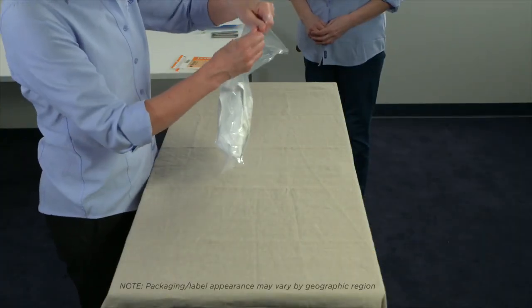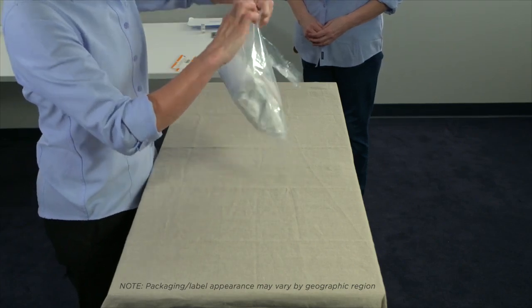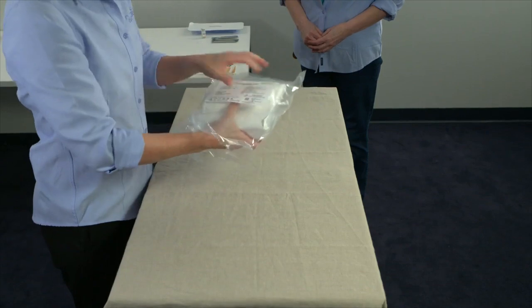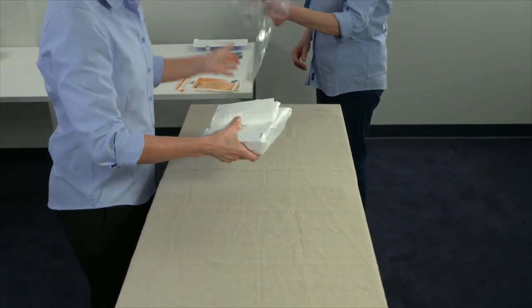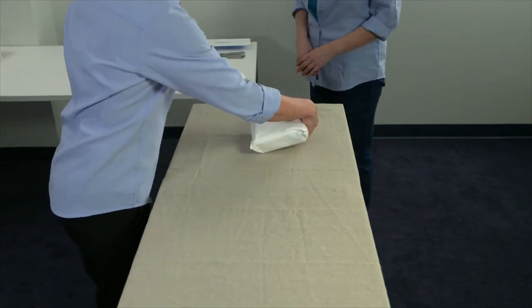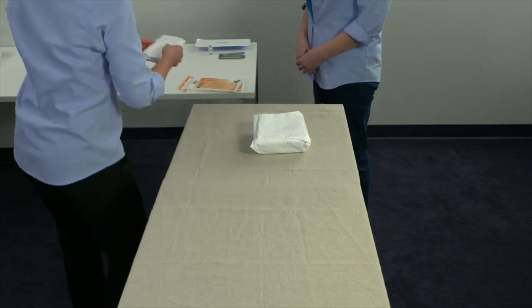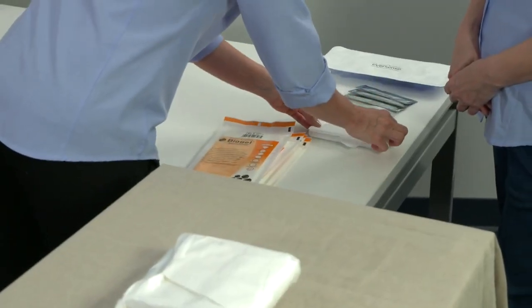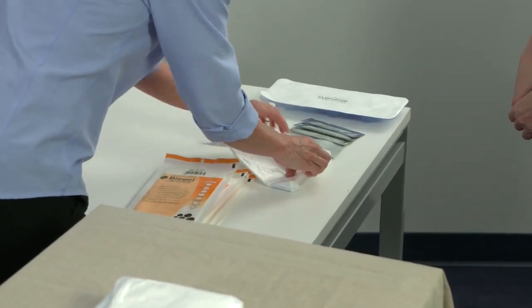First, open the outer plastic package of the custom procedure kit. Without unwrapping the two packages inside, remove them both from the outer plastic wrap. Keeping the larger package wrapped, place it on a clean, flat work surface. This is where you'll create your sterile field. Next, place and open the smaller package of non-sterile items alongside the insertion tool and sensor boxes.